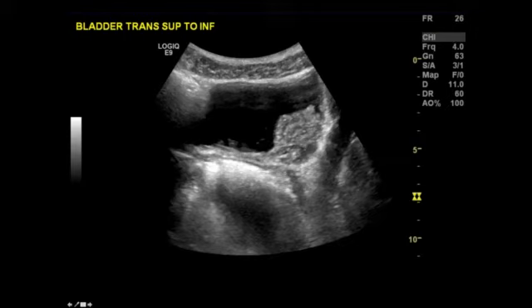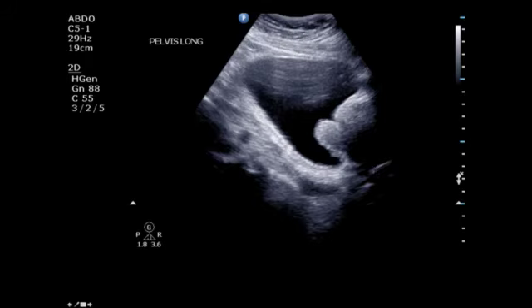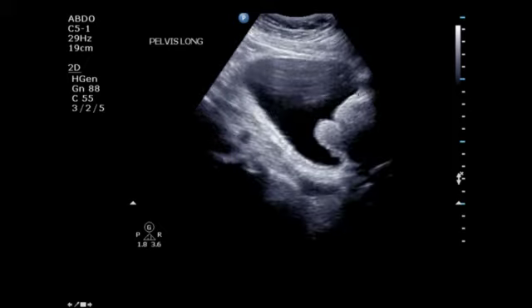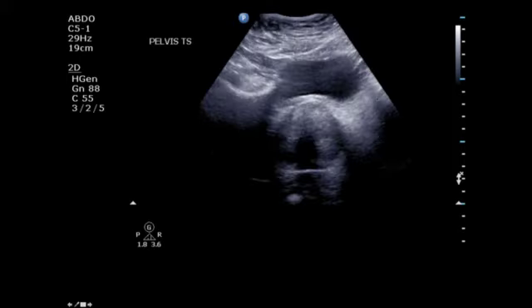This is just simple prostatic hypertrophy. This is the middle lobe of the prostate. It's hypertrophied and growing into the bladder. It's not malignant. It's just a very hypertrophied prostate, a very big prostate, which then grows towards the bladder and will cause outflow obstruction at some stage.